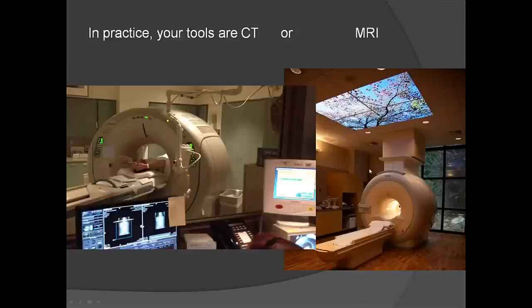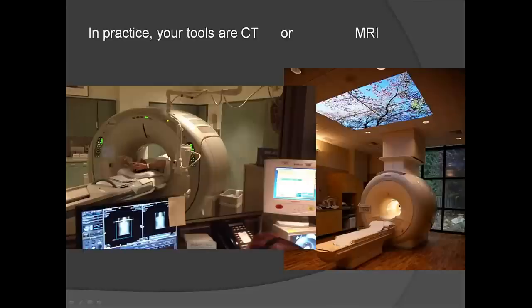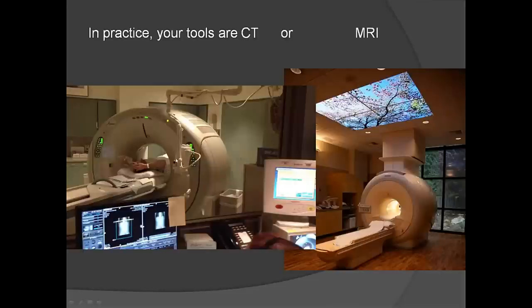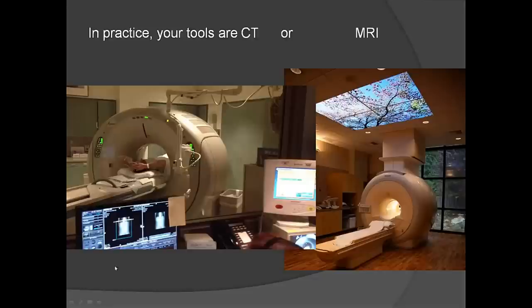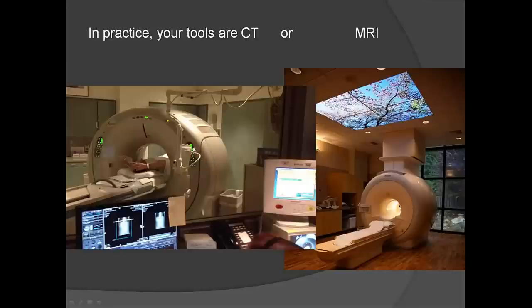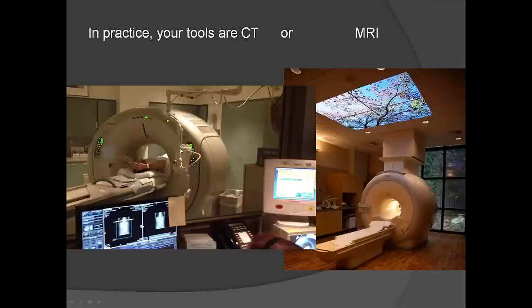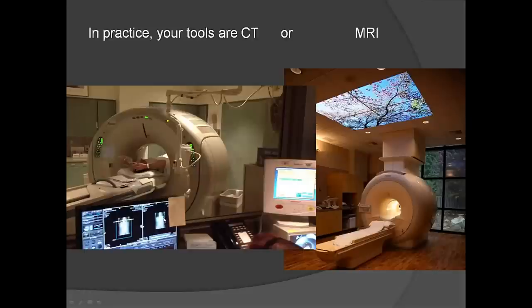In practice, comparing CT scan versus MRI: the CT scan is very fast nowadays. A high-speed CT of the abdomen and pelvis — a much bigger area than brain coverage — takes only about 10–20 seconds. You can see the CT console, where a voice control tells the patient to hold their breath, the patient stops moving, the CT starts, and images generate and pop up on the console.